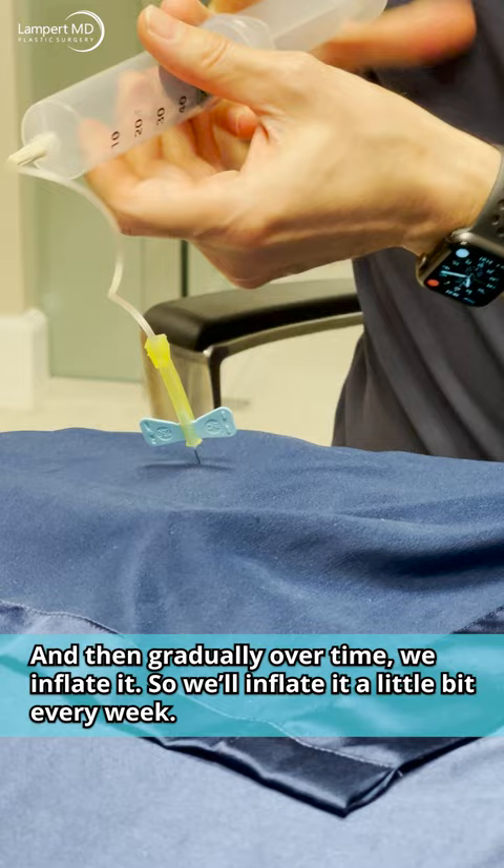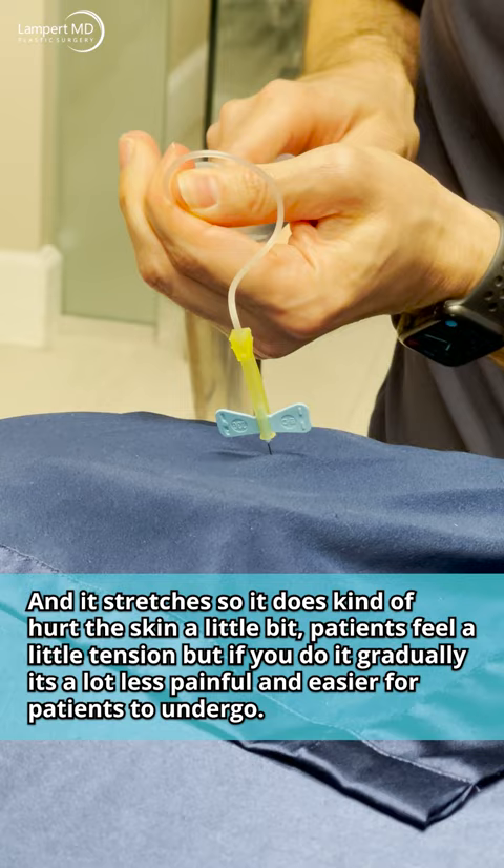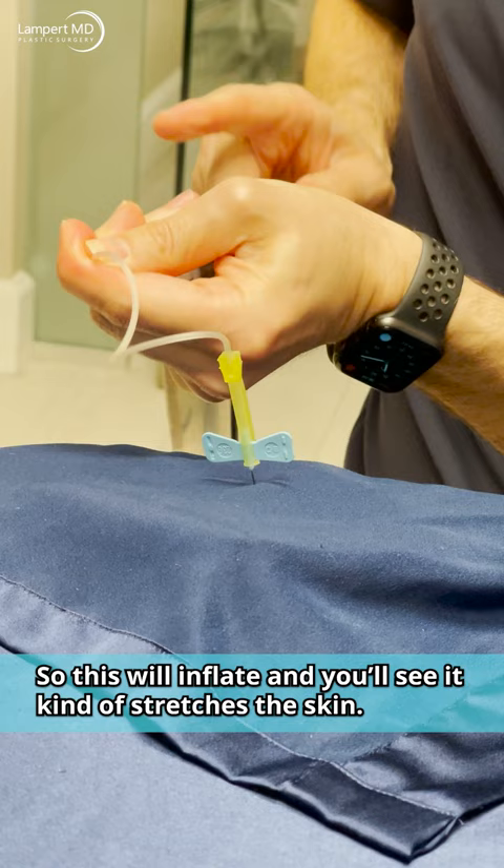Our assistant will hand us this — normally we use saline — and we'll go through the skin with a little needle. We can feel the metal on the back so we know we're in it, and then gradually over time we inflate it a little bit every week. It stretches, so it does hurt the skin a little bit and patients feel some tension, but if you do it gradually it's a lot less painful and easier for patients to undergo.